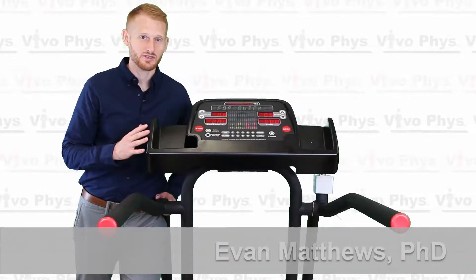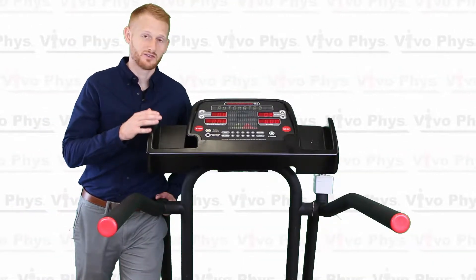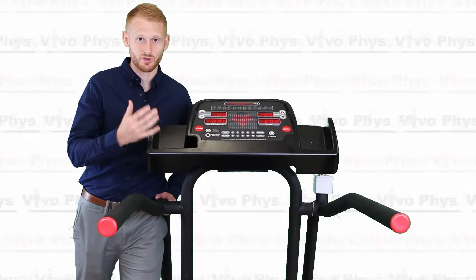Hi, I'm Dr. Evan Matthews. I'm here at Montclair State University in an exercise science lab to show you how to use a TrackMaster treadmill. This is a very common treadmill for exercise science labs because it can go really fast and go to a high grade.